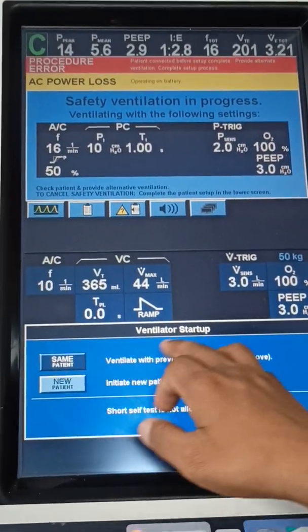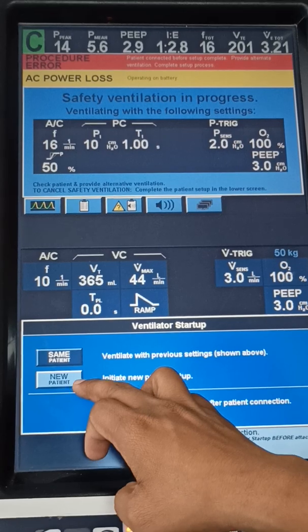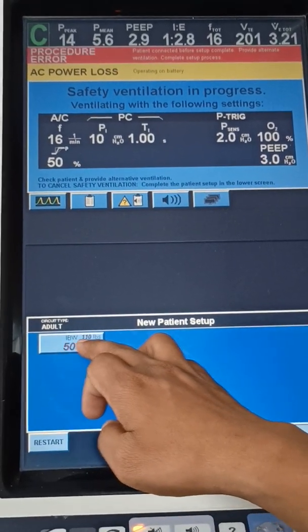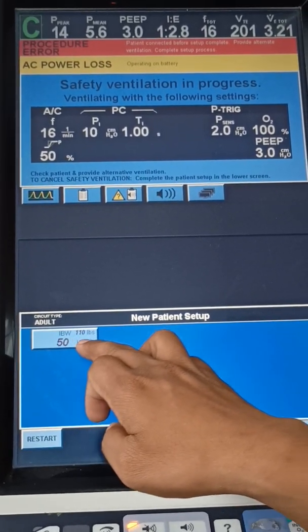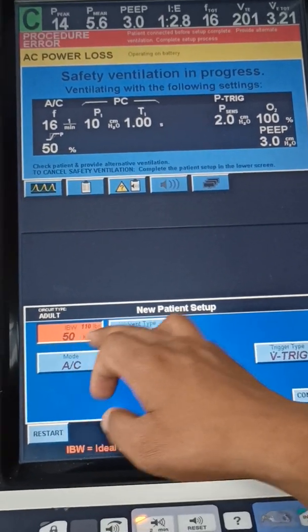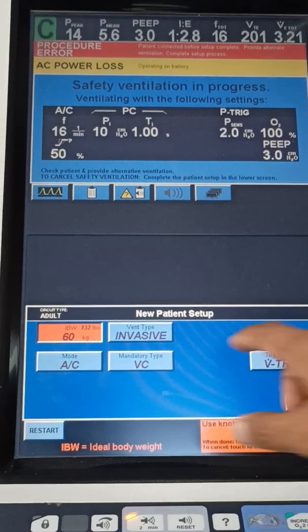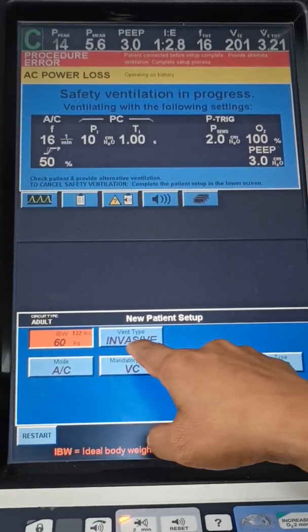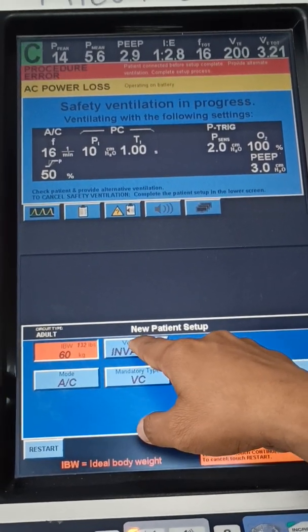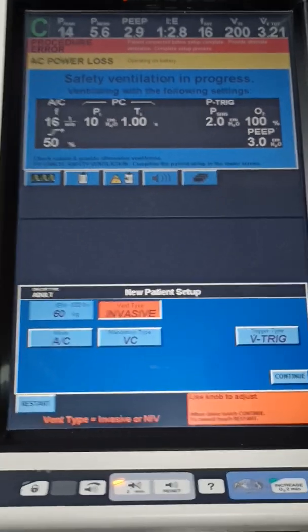On the screen you will see the ventilator setup — same patient or new patient. I am selecting new patient. Then there will be ideal body weight, so I selected ideal body weight of 60 kilos. The next option will be ventilator type: invasive or non-invasive.